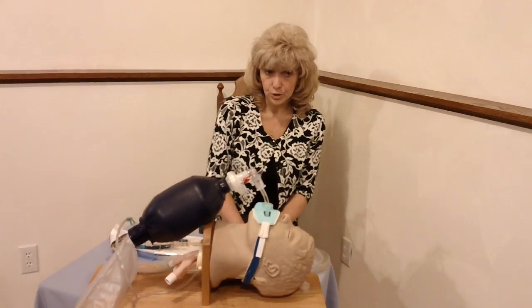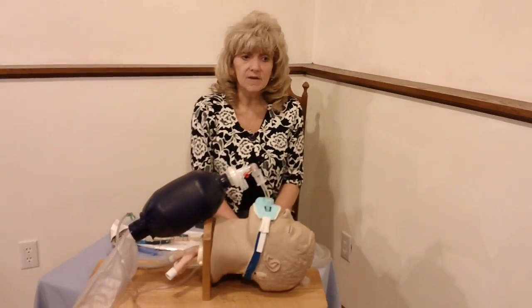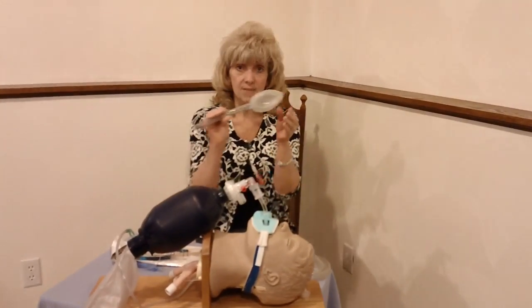Laryngeal mask, the LMA, is an advanced airway that is considered an alternate to an ET tube or an endotracheal tube. Size 5 is used for adult males, size 4 is used for adult females. This device is used pre-hospital and in the emergency department. This is the LMA tube.